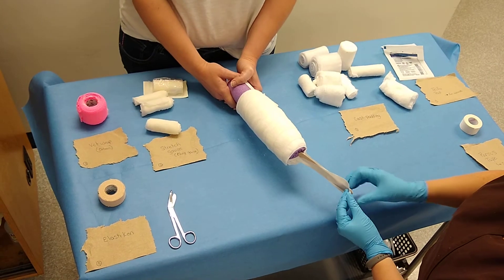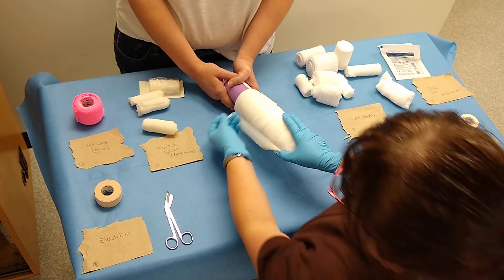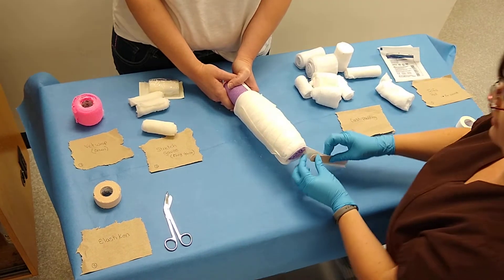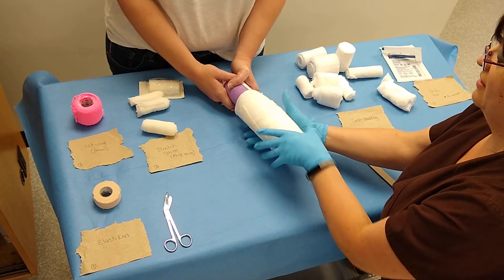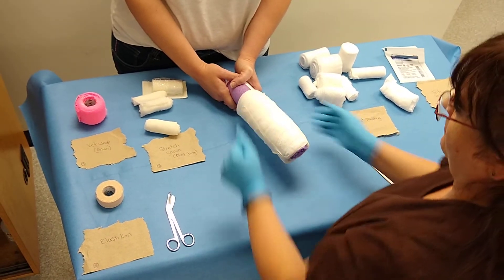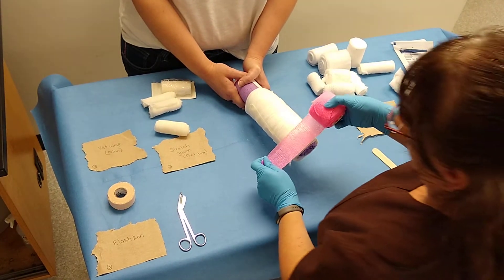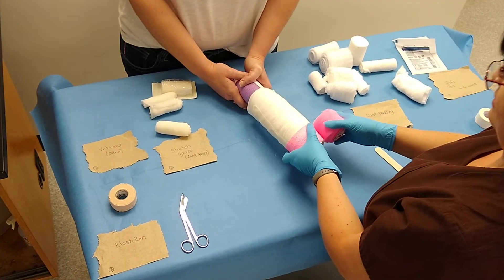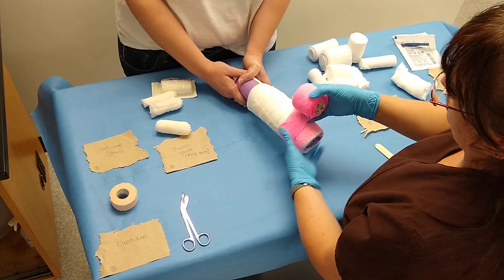Next, you're going to turn up your stirrups — turn the sticky side up. That's going to keep it from slipping off the leg. The wet wrap is next; that's to keep all the urine, feces, and rainwater off of the bandage. Overlap by 50%.